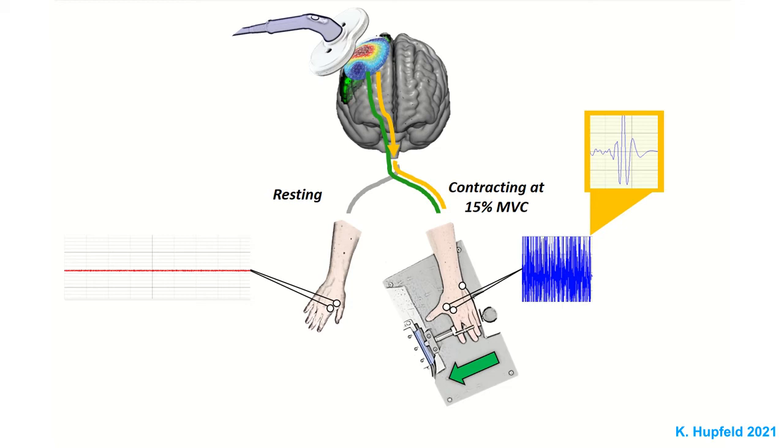Almost immediately, in the EMG activity, we can see an MEP, or a motor evoked potential. This is shown in the yellow box. MEPs are essentially a measure of excitability of motor neurons. More specifically, MEPs are spikes in the muscle activity that result from volleys of action potentials along the corticospinal tract. Usually, but not always, the MEP is also accompanied by a small twitch that you can see in the hand muscle.